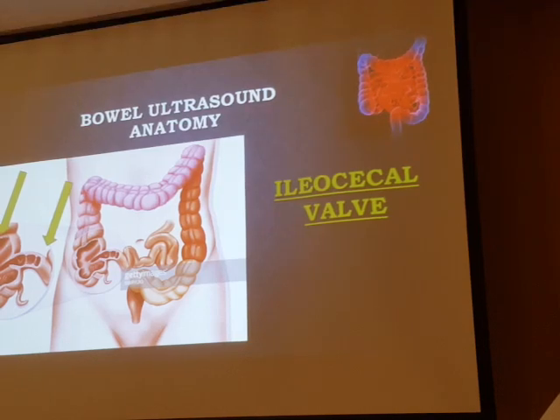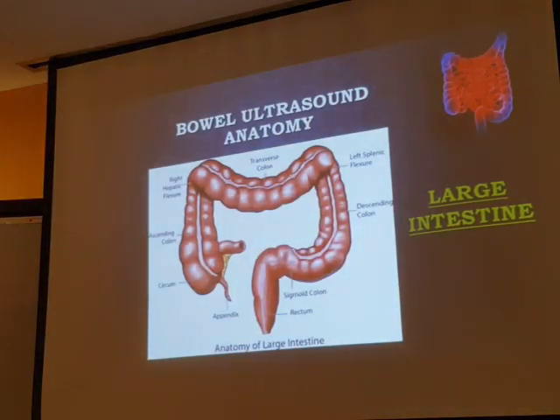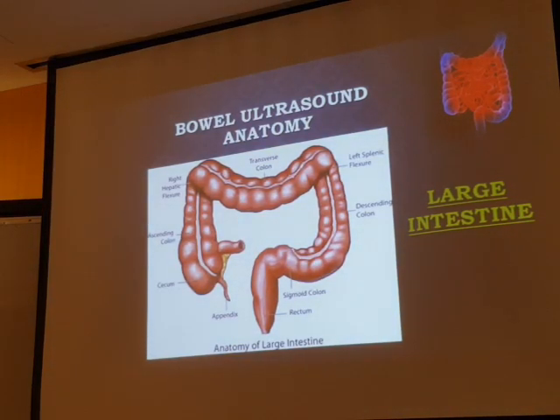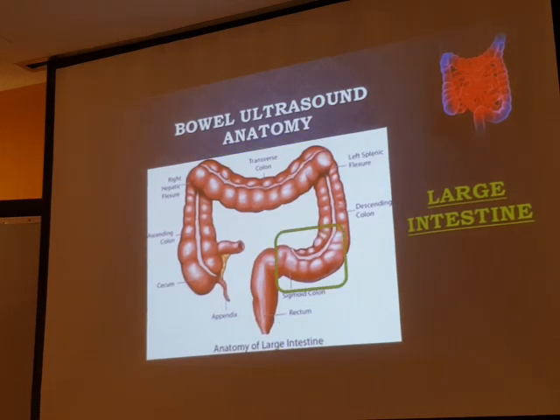Part, it can be examined, evaluated, and assessed by ultrasound. Going to the final thing, which is the large intestine. The first part is the cecum, and then the colon, which is ascending, transverse, descending, sigmoid, rectum, and the last and very important part, which is the appendix.